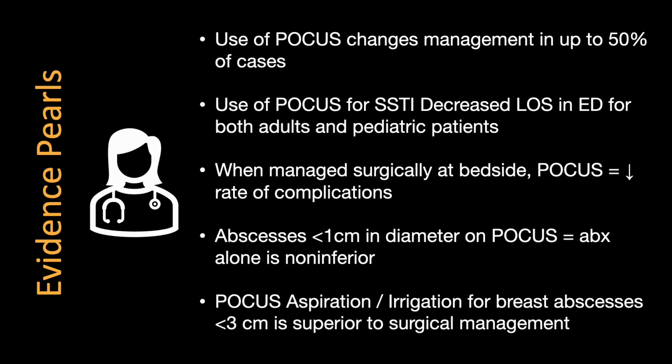In prospective studies conducted in the emergency room, the use of ultrasound compared to physical exam alone changed management in up to half of cases. So what they found was that without ultrasound, more patients were misdiagnosed as either having an abscess when in reality they just had edema from cellulitis but no discrete pocket of fluid, or they were not offered an I&D due to clinicians missing subtle abscesses on their physical exam. While saying that up to half of all patients could be better served by ultrasound investigation is a bit of a stretch for me personally, it does reinforce that sometimes our physical exam isn't as sensitive as direct tissue visualization, and the use of ultrasound to do this is a low cost, low harm modality, and a low risk for our patients.